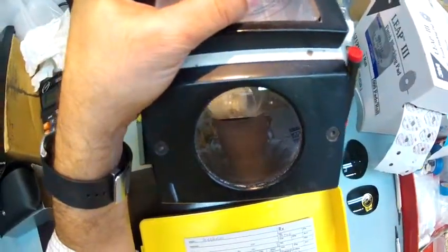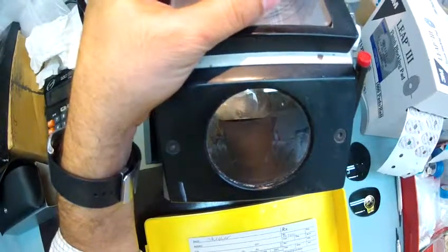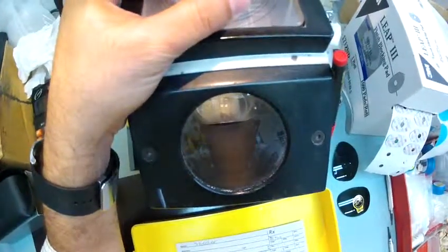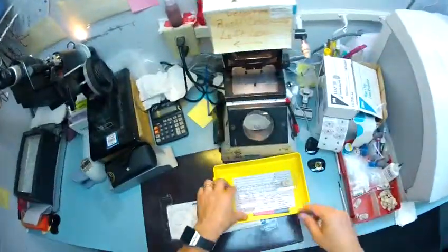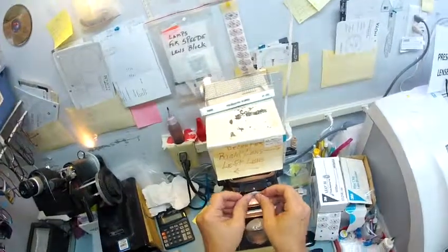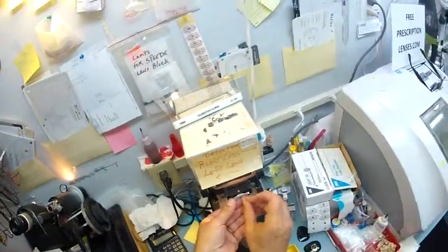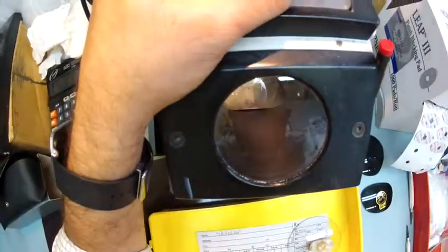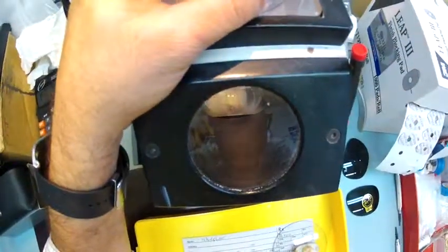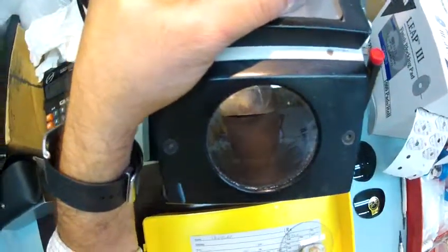I have essentially an optical crosshair, and I'm just making sure your lenses line up in there perfectly. Go a little bit slower for the bifocals. There we go. That one is on there. And now I need to do the same thing for the left. Go ahead and put that one on there. Pull the tape away to make that side sticky. And now let me get this lens lined up just perfectly. You only get one shot at this.